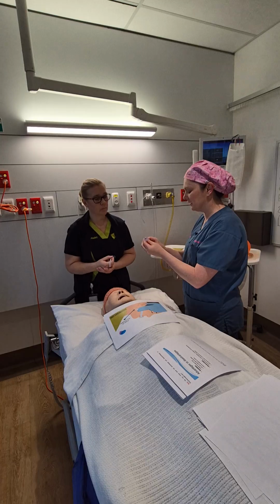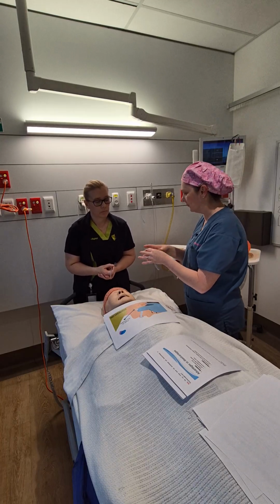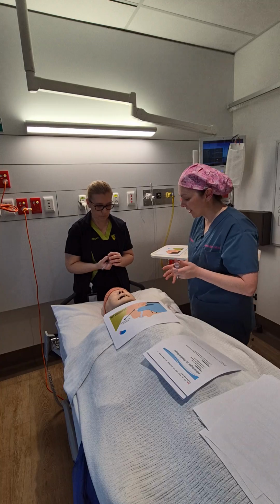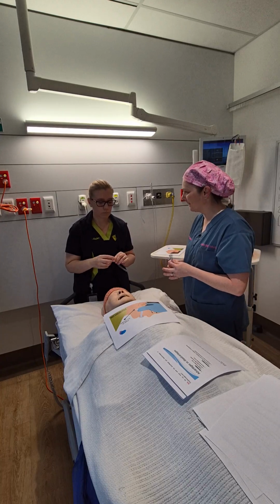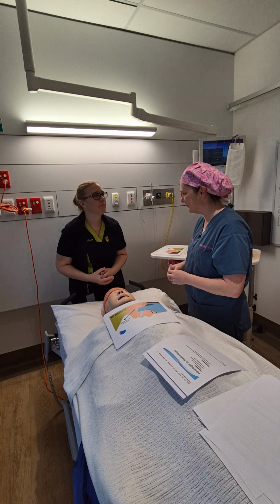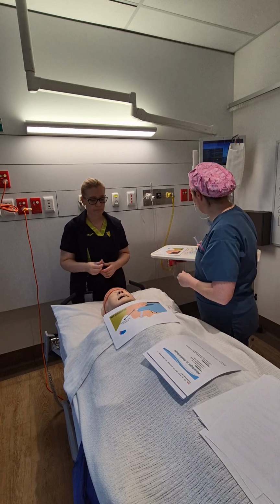And this one doesn't have any colour labels or anything like that, but they have sizes written on the side. Okay. So do you know how to measure for a nasopharyngeal? Isn't it from the nose to the ear? Perfect. Excellent. Wonderful. So that's probably a good size. What size is that one? Yes, I think a 7 would be good for him.